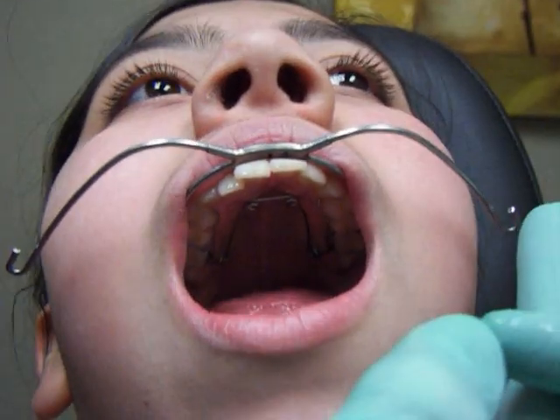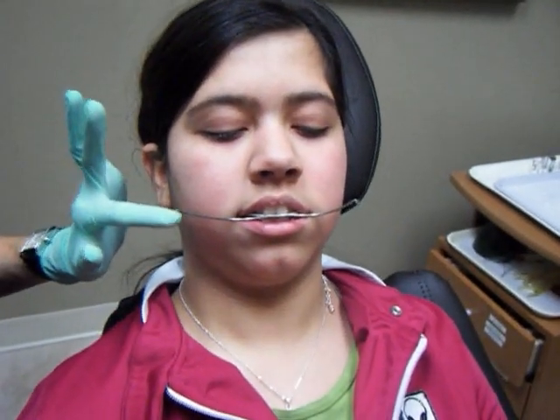So now we're going to attach the straps to the outer bow. I'll show you how to do that.